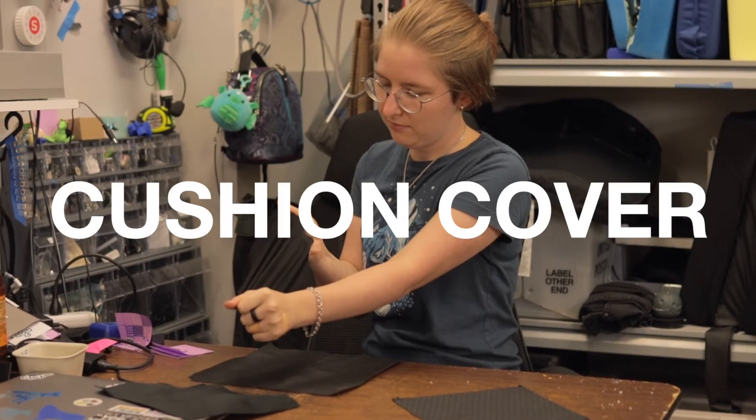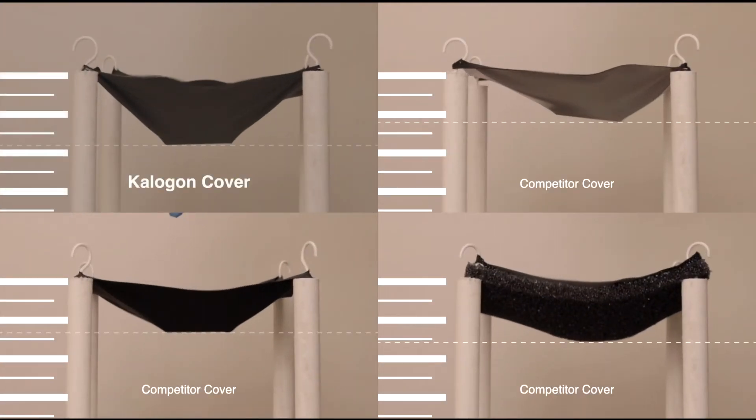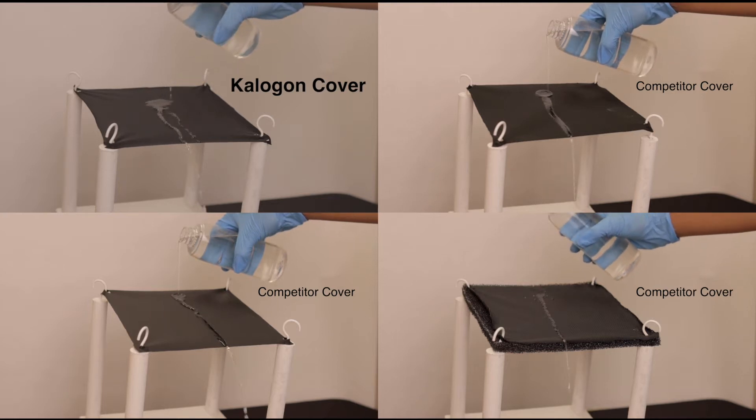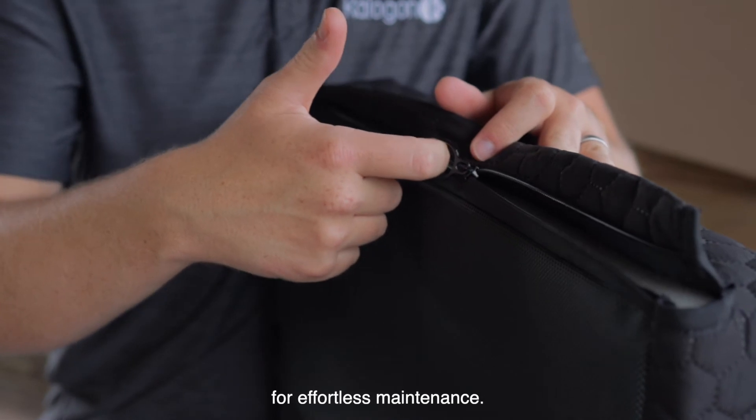Our cushion cover is a unique manufactured fabric which allows a four-way stretch while preserving all of its water resistance properties. The Orbiter also has a very reliable zipper for effortless maintenance.